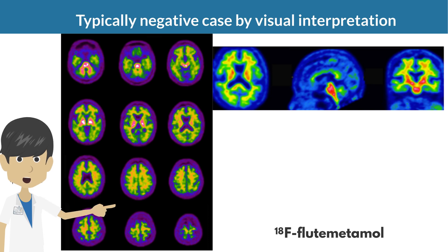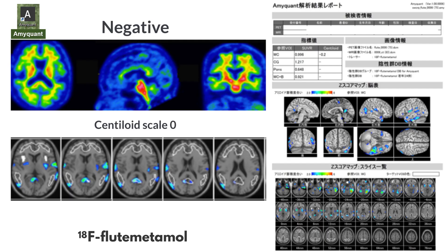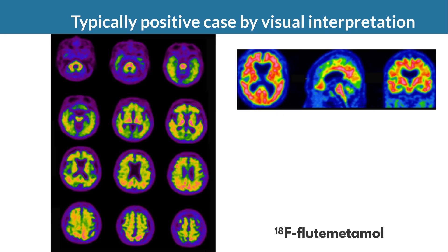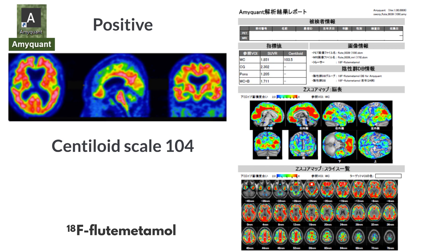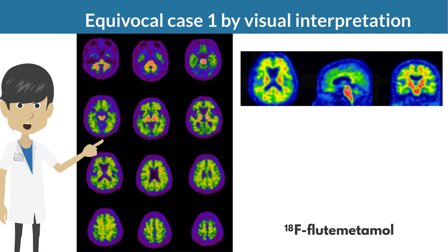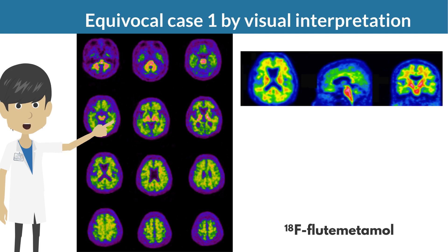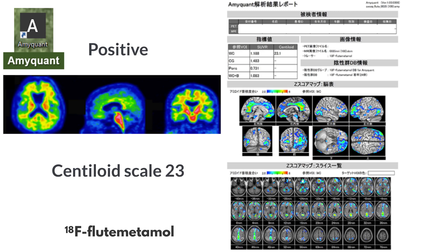A flutemetamol PET of a visually obvious negative case shows a centiloid scale of zero. The target VOI is indicated by a white line in the tomogram of the Z-score map; regions with a Z-score of 2 or higher are shown in color but are not included in this target VOI. A visually obvious positive case shows a centiloid scale of 104. An equivocal case shows no focally increased accumulation but somewhat diffuse cortical increase; the centiloid scale is 23, and posterior cingulate gyrus, precuneus, and medial frontal cortex show significantly increased accumulation on the Z-score map, suggesting amyloid positivity.